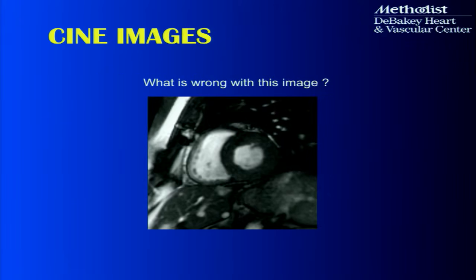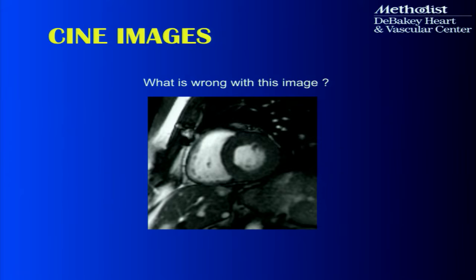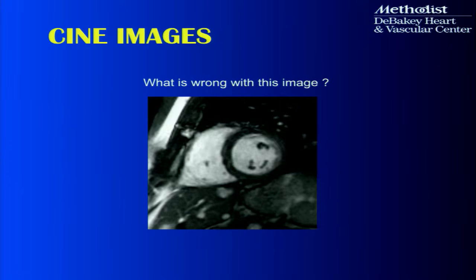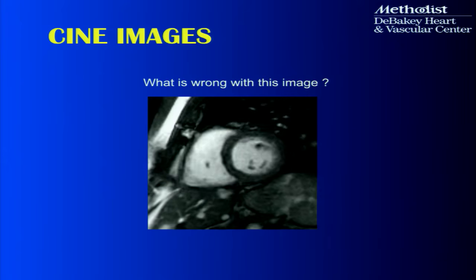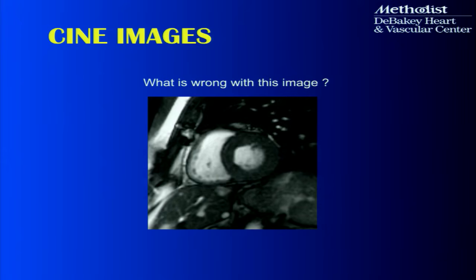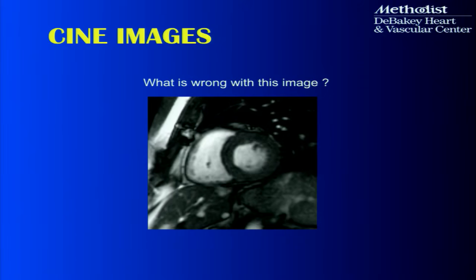Now, a couple of things to keep in mind, and these are when things can go wrong. These can be either patient-specific factors or operator-specific factors. So here's an example. I think it's important for us, when you see the images, to be able to tell what the problem with the images is, to then know how to troubleshoot it. So what's the problem here? The first step is what's wrong? Look at this acquisition and what do you think about it?